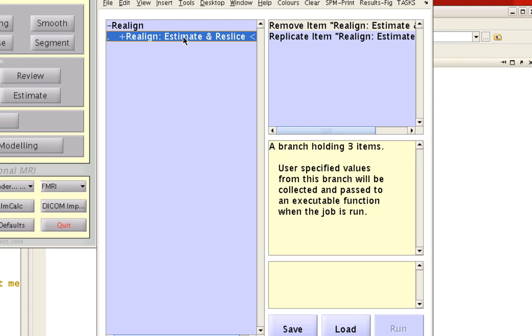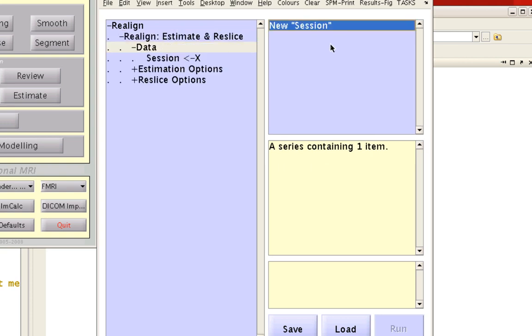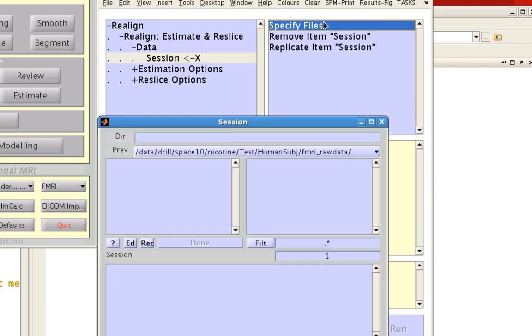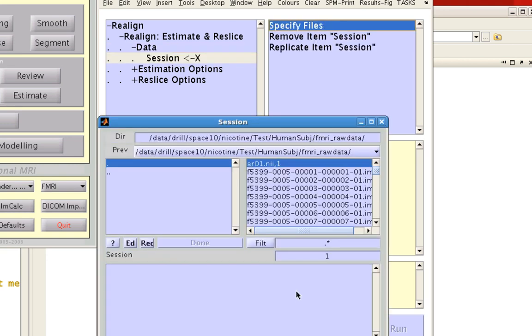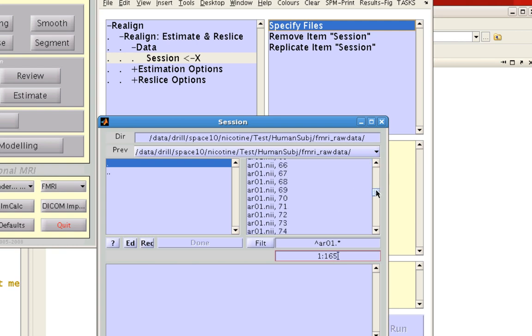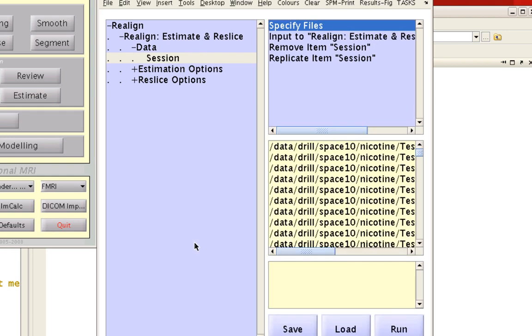Within this, double-click to open the Data option. Click New Session, and then Specify Files. The output from slice time correction was ARO1.NII, so I'm going to select that file and select frames 1 through 165, which are all the files available. That looks good, so I'll select all and click Done.